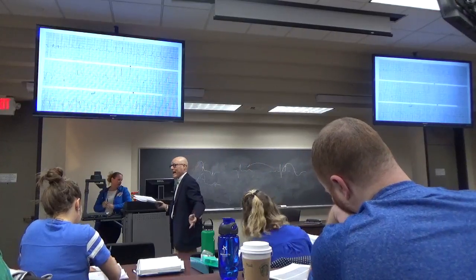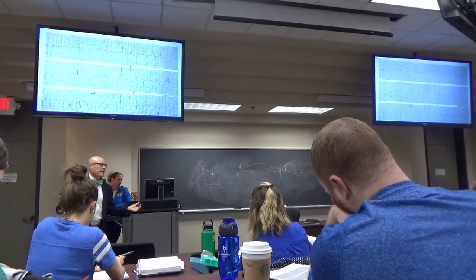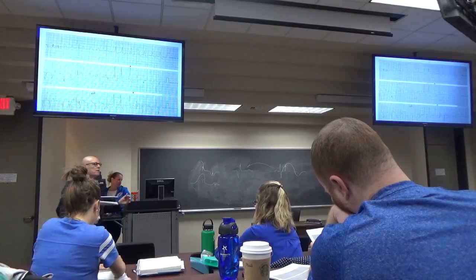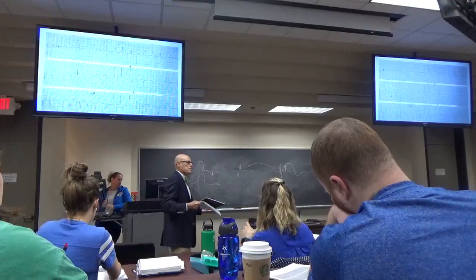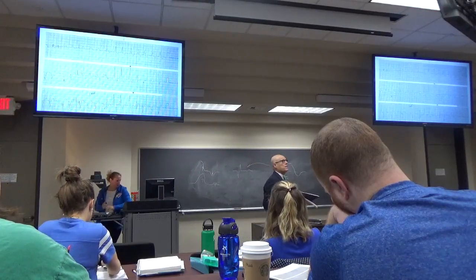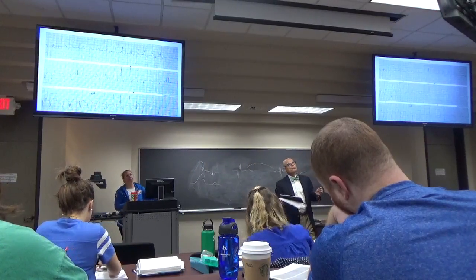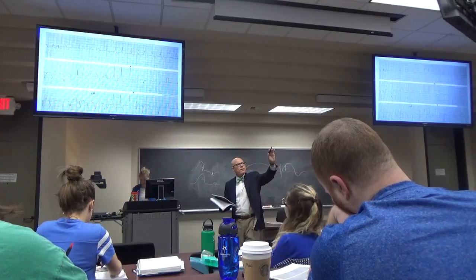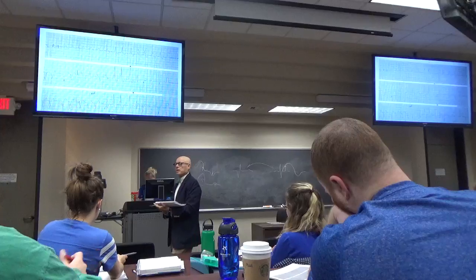The patient might have it. If you got an echocardiogram, you might have it. The conduction is so abnormal because of the right bundle, you wouldn't be able to diagnose it. But Tammy's right in that V2 and V3 look strainish because they're asymmetrical.